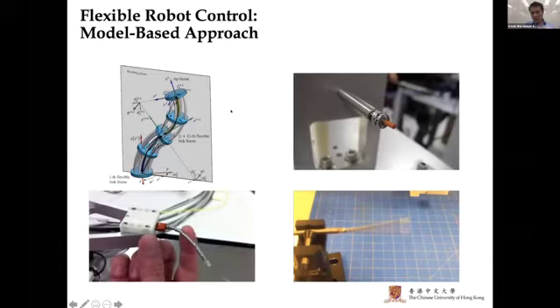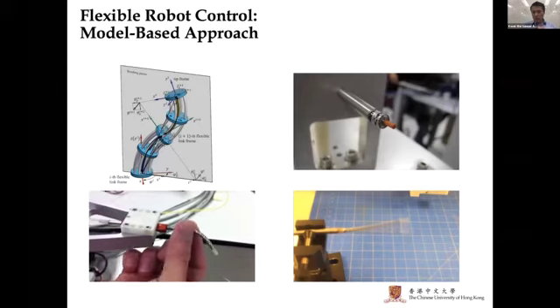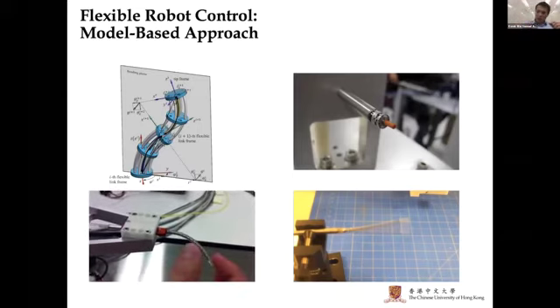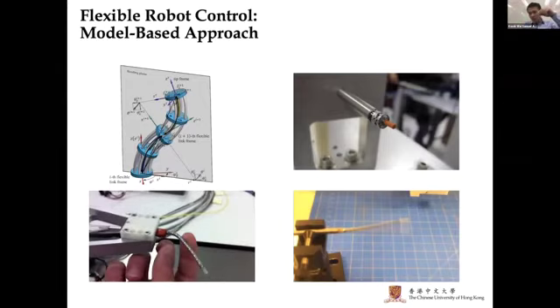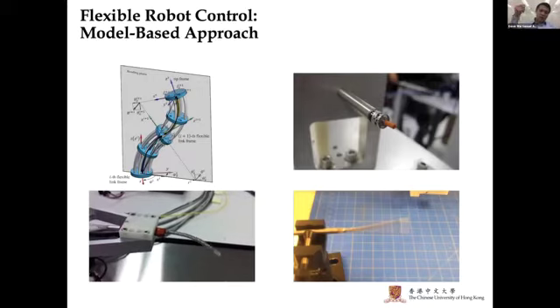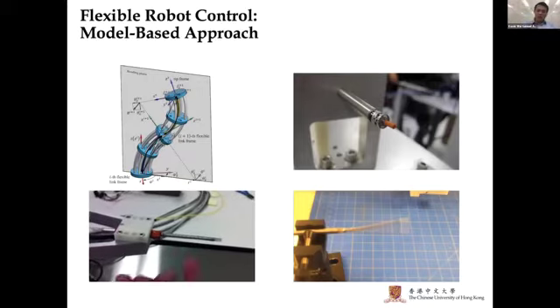And this is another early prototype I built when I was at Intuitive Surgical. This is a flexible instrument with optical fibers inside so that you can maintain the shape of the instrument, even though you are applying force on it. The instrument by itself can maintain a certain pointing direction and angle. Later on, they used that technology to build the Da Vinci Ion system, because when you use the flexible robot to go to the lung, you need to be able to change direction.